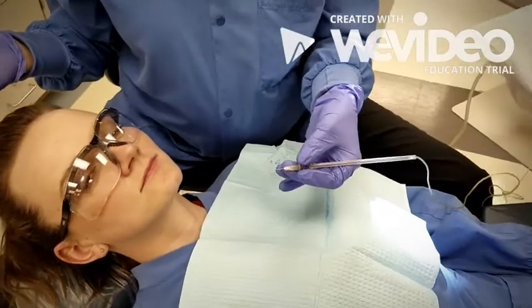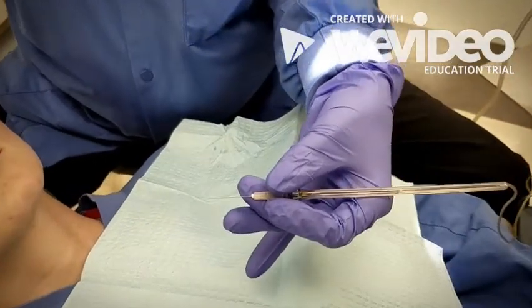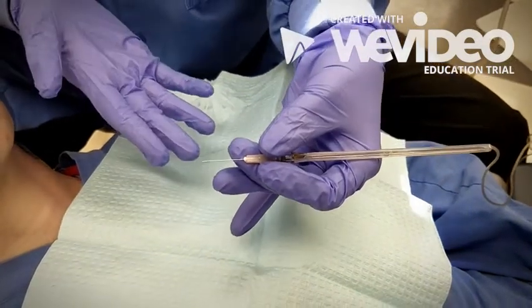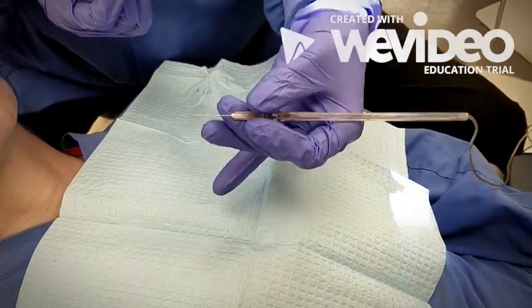With the wand, there are a few different things to know about techniques. First, the grasp is different. The wand utilizes a pen grasp, just as we would with ultrasonics. Ergonomically, this is more natural and comfortable for the operator. Just like with ultrasonics, it forces the operator to have a feather-light touch on the handpiece.